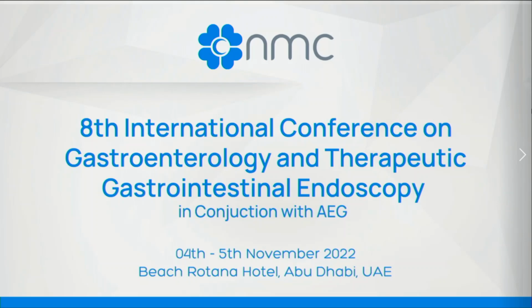The reason for that is that I believe that we have a more stable position of the scope in the prone, so the scope does not have a tendency to slide back into the stomach, and you don't have the over-insufflation of the duodenum because it is compressed by the table. Thank you.